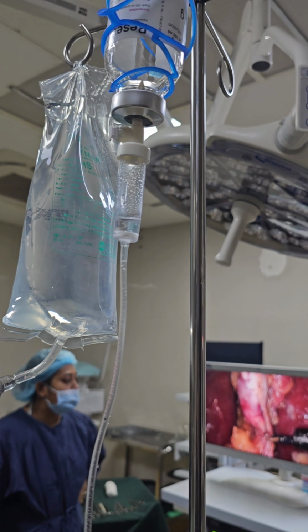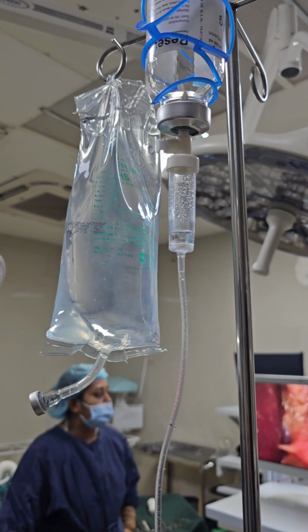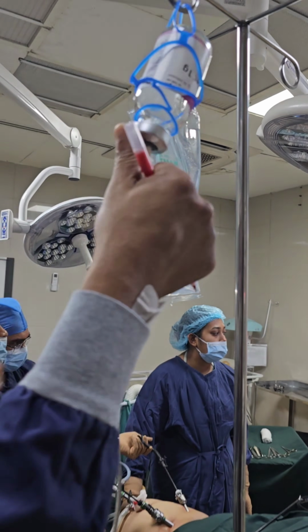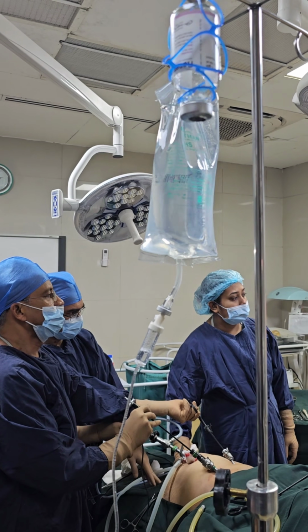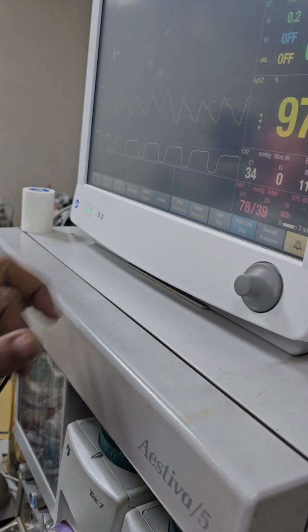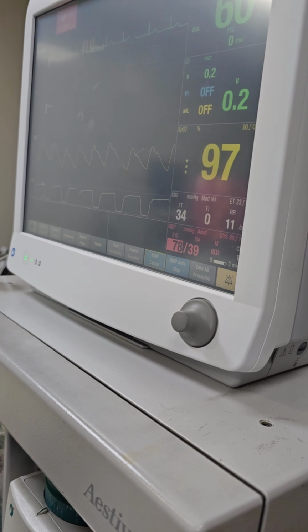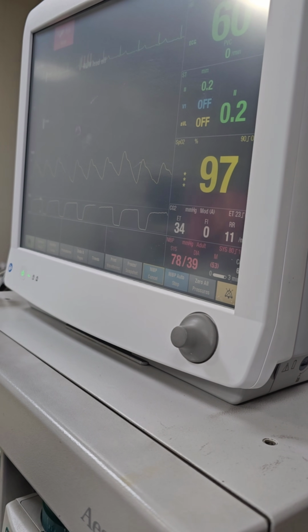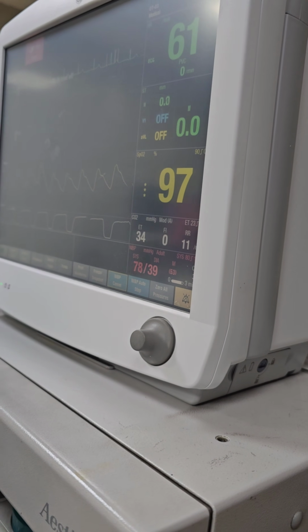We are seeing that the paracetamol has been given, so we disconnect the bottle of paracetamol, and introduce the saline set into the Hartmann saline bag, and we are giving a bolus of saline for increasing the blood pressure, as we think that she has been starving for 6 to 8 hours, so there must be some fluid deficit. We are trying to recover it as quickly as possible, to make the blood pressure comfortable for us.